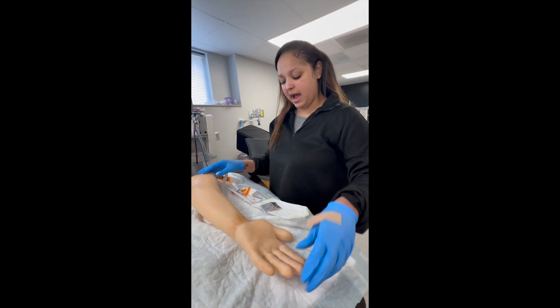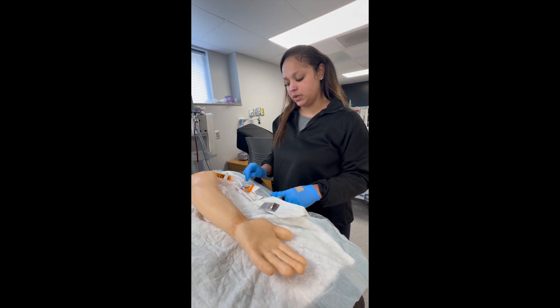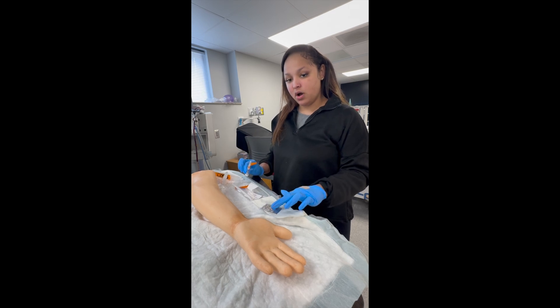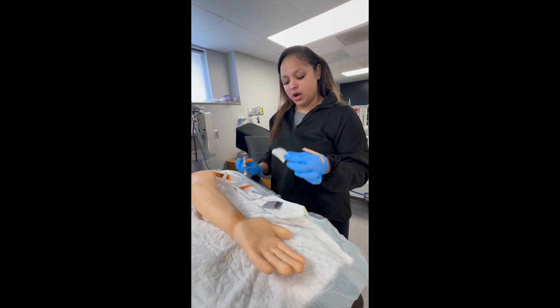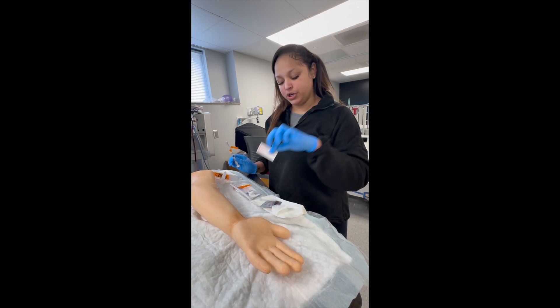I have an ABG kit which consists of a 22 gauge and a 23 gauge needle. Today I'll be using the small needle. It has an alcohol prep pad, a gauze, a band-aid, and a label for your syringe.